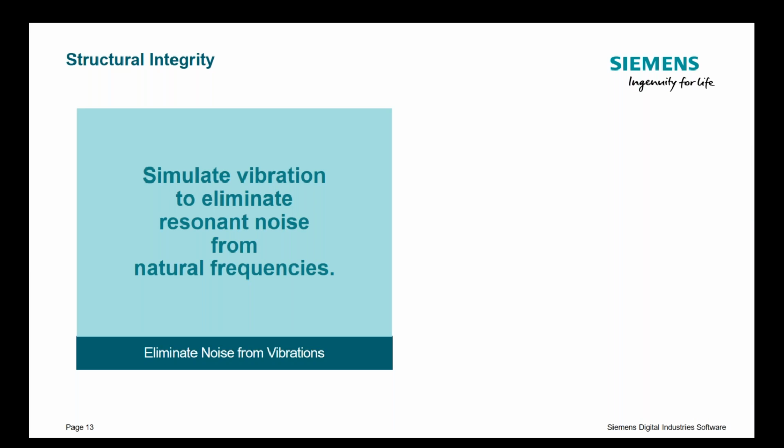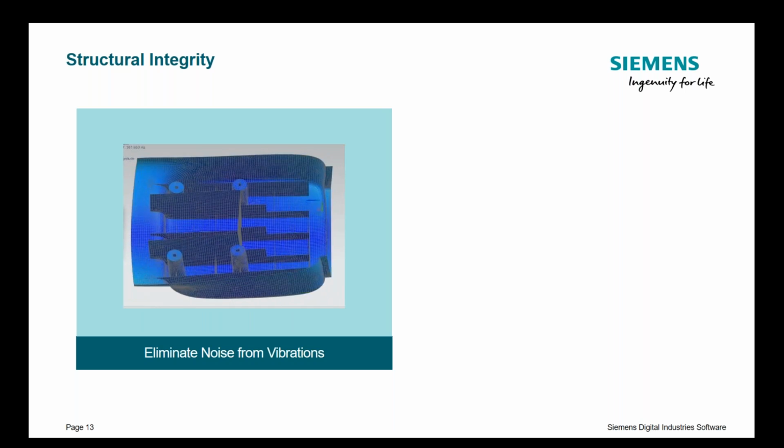So here are a couple of specific examples of 3D modeling and simulation that can be utilized for performance engineering, in this case for the outer case of an infusion pump. First, we look at 3D modal analysis, which simulates vibration and can be used to understand natural frequencies. This can steer the design away from making buzzing or humming noises that might occur if the motor and pump rotations are matching natural frequencies.